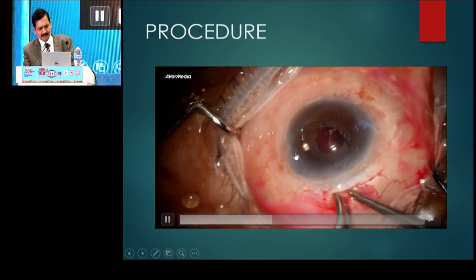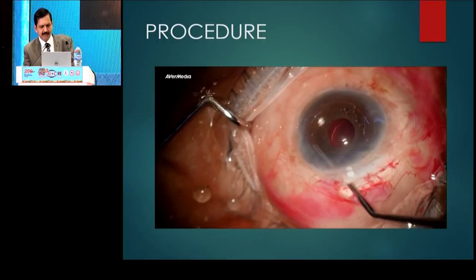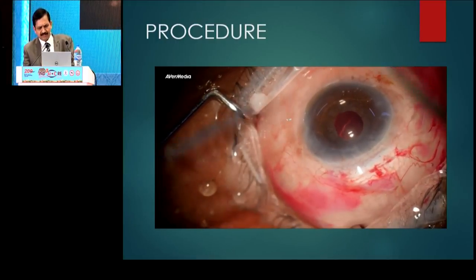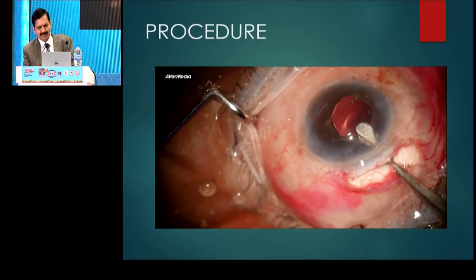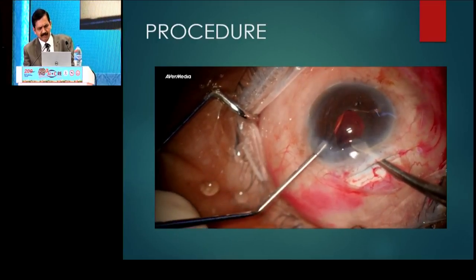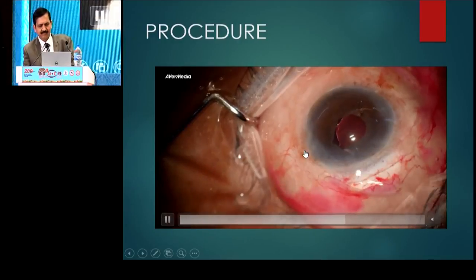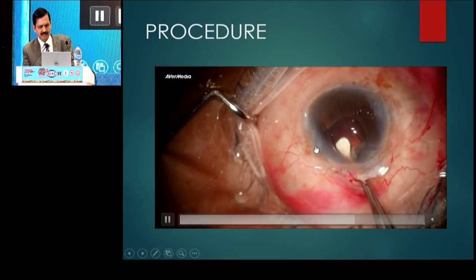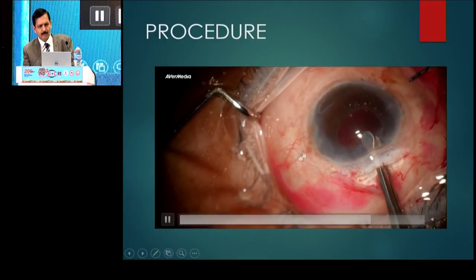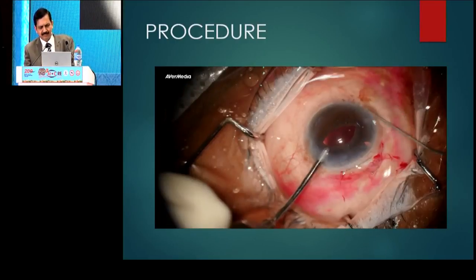After that, place the lens in the anterior chamber and let the optic cover the pupillary area exactly, then mark the place. Look for the landmarks where you are going to do the tucking. Under viscoelastic, using a lens-holding forceps, push one haptic first, then the other haptic over the IRIS and then lift the IRIS. You get the mark where exactly the claw is and then tuck the IRIS. The end point is to look for the cleft — that fold on the IRIS. Only then you can go ahead with tucking the second haptic.